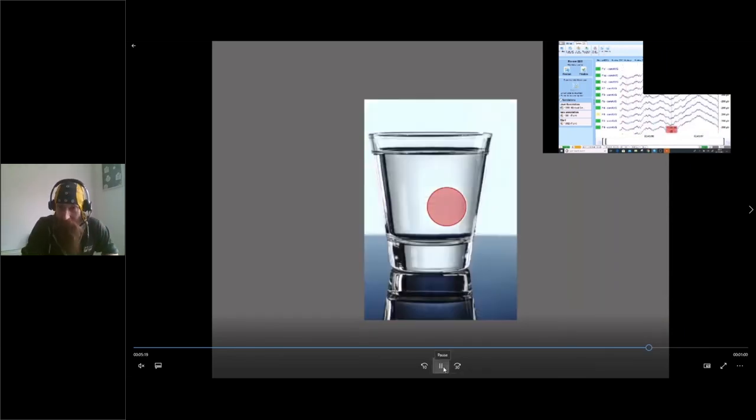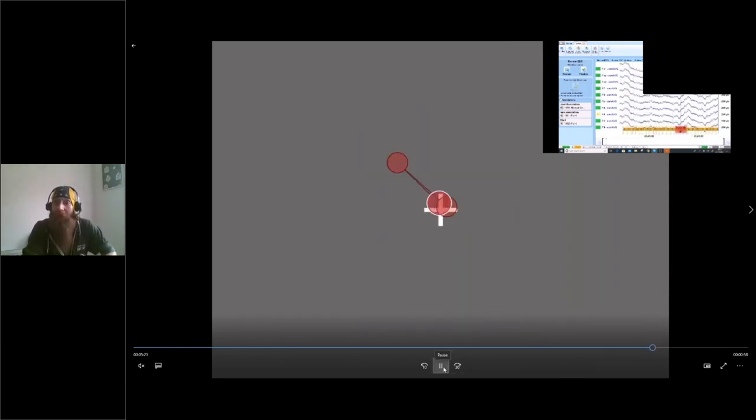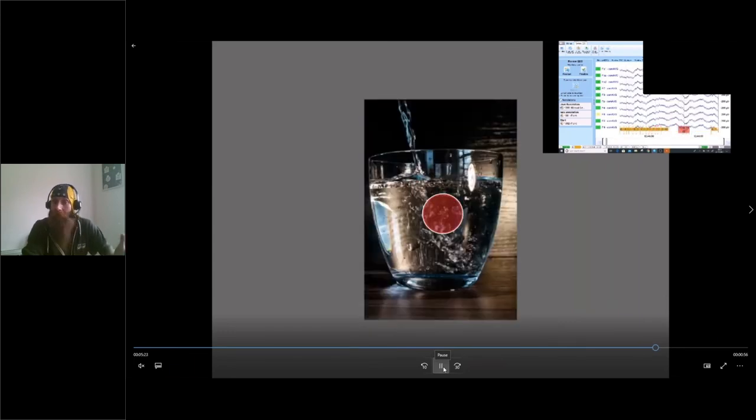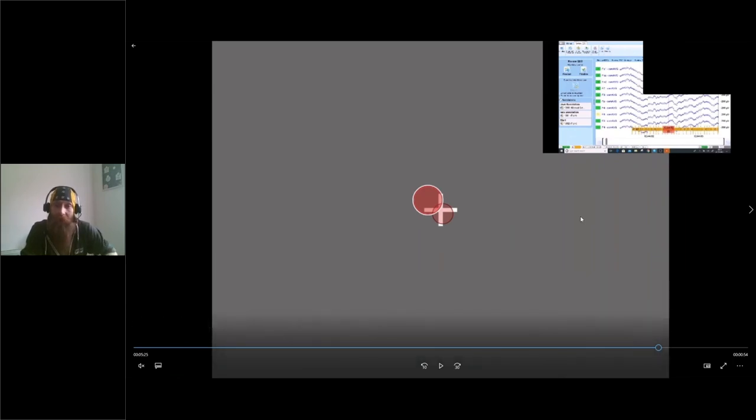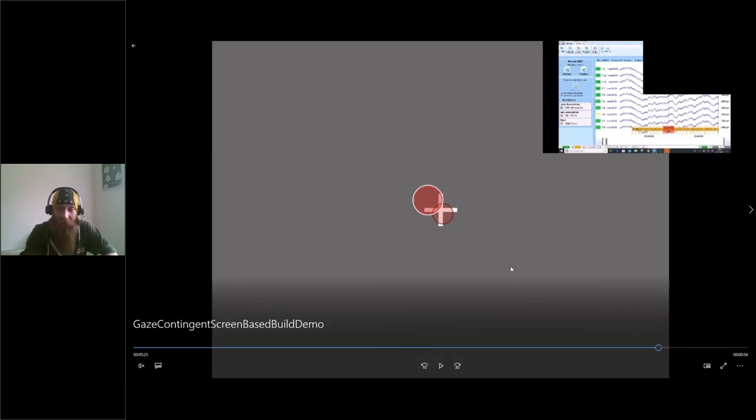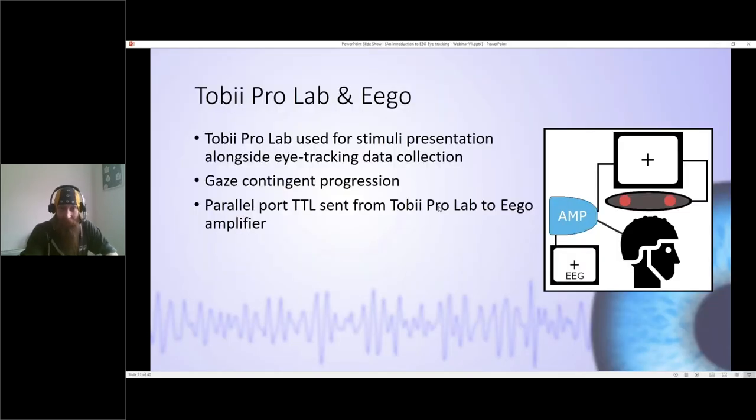Okay. Simple implementation. Hopefully we can all see we've got marks in there, and obviously from this point there are a number of ways that we can then take that to analyze post data collection, so long as we know that this is where these recordings match up, this is where they start together. We can then do a lot of things with that data in a variety of different ways. So that should be our simple setup.